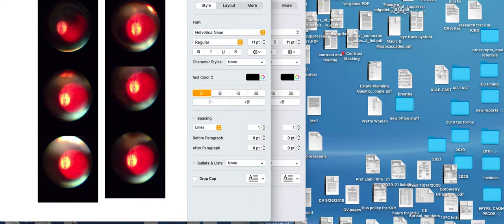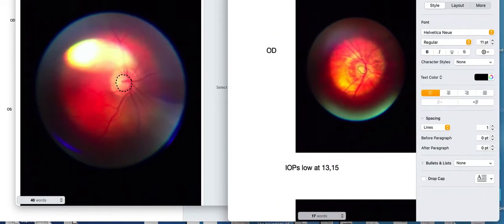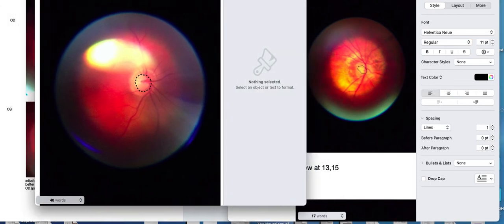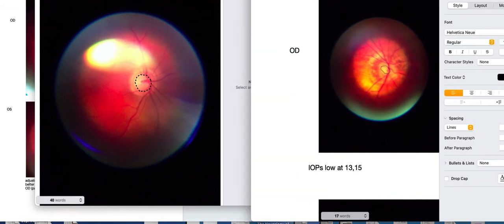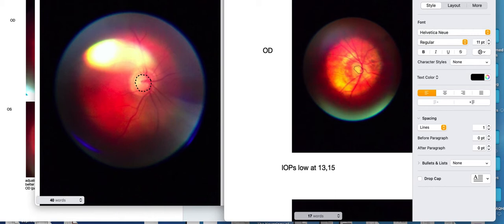There are folks that I've seen who I cannot get a good look in their eyes. But because of the angles that we can get with the panoptic, and because we're a little further away, and because of this running video concept, then we can get some pictures. Sometimes I don't get a look at the optic nerve until we get pictures.